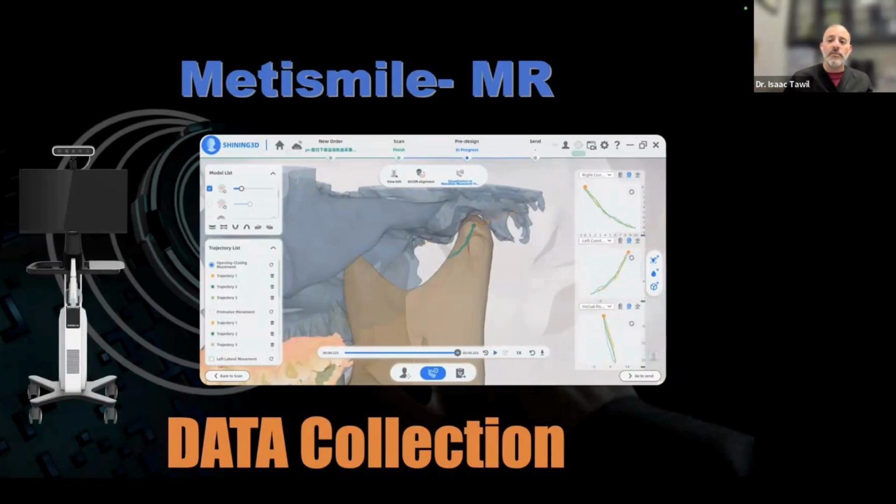So we can see if the patient is already in temporomandibular dysfunction, or if they're in a good position, and we can analyze their vertical dimension. This is all wonderful to be able to say to our patient, you know, you have TMJ already, you have temporomandibular dysfunction. Maybe we shouldn't open up your bite. It's going to make you worse. Or let's fix your bite first. Let's get a new analysis, check the condyle position, and see if that helps your bite. And this will hopefully prevent a lot of difficulties and breakages of a lot of materials down the road as we keep progressing.